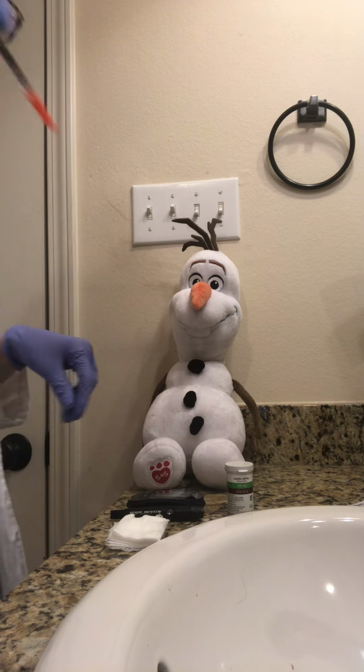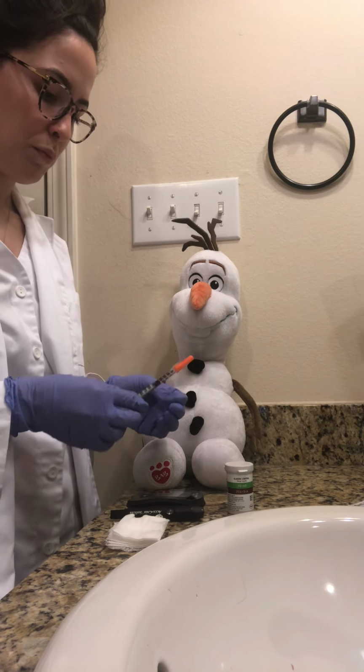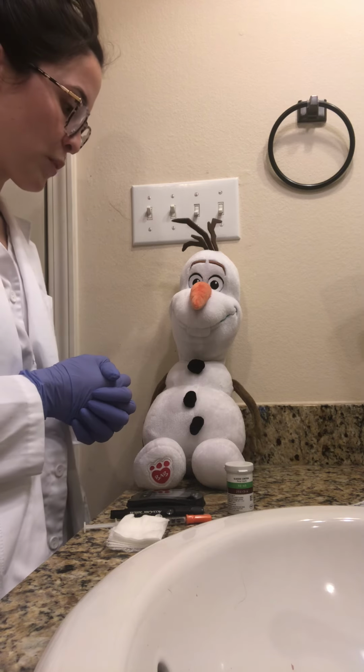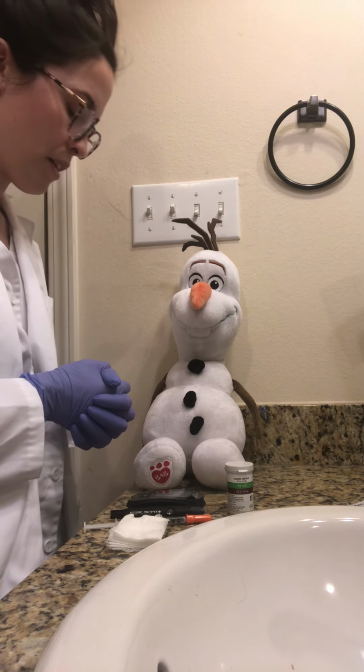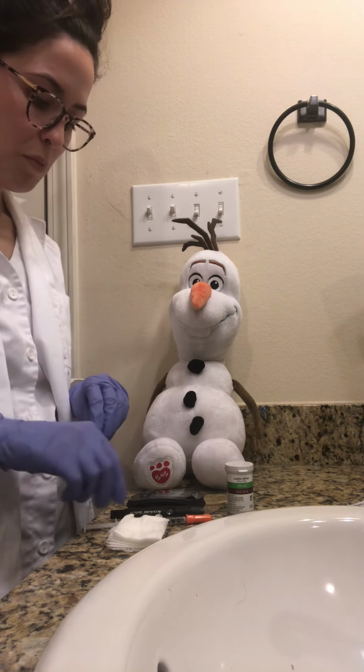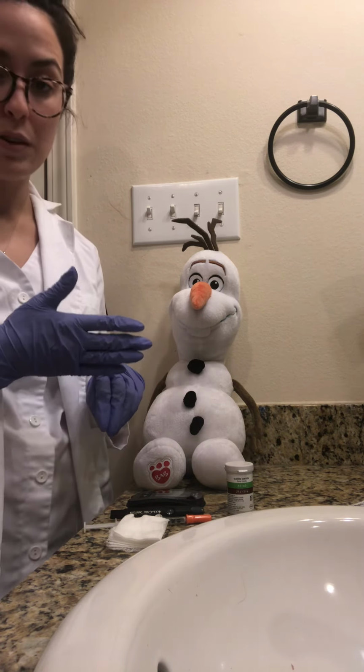And it is labeled and all drawn up. And Mr. Olaf, prior to administering the insulin, I just want to verify one more time your name and date of birth. Can you verify it for me? Great. Okay, so now the site is completely dry.